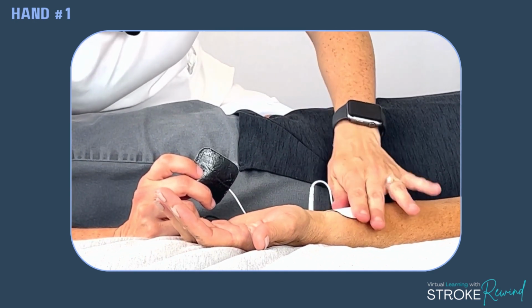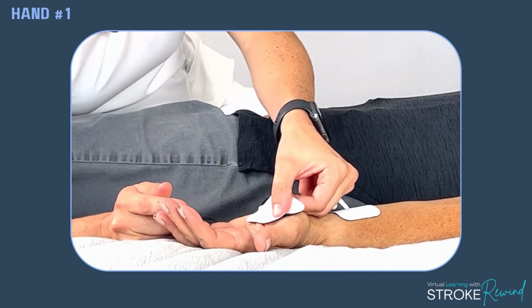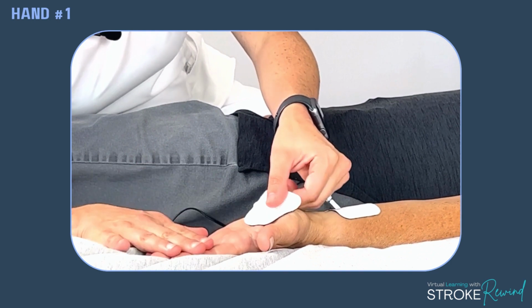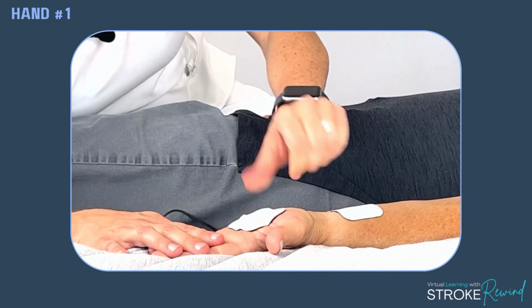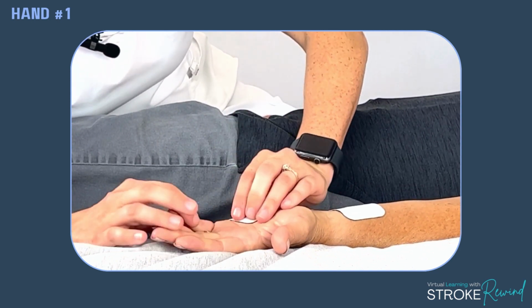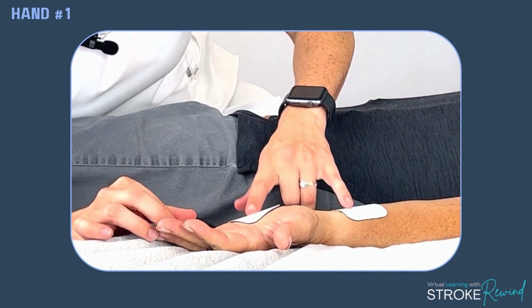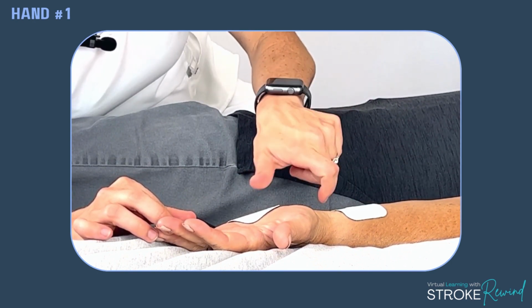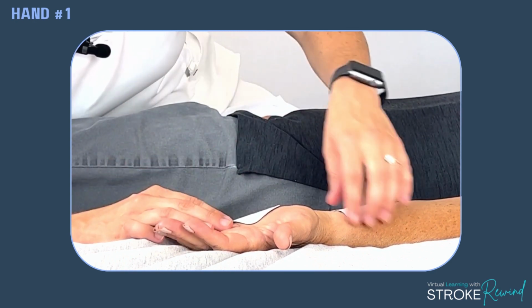Let's say I put the black, see this black electrode up top. I can place this red one maybe by the thumb. Maybe I'm placing it up a little more towards the fingers. Maybe I'm going smack dab in the middle. You can move it to the side to kind of remind Pinky how to move. All you have to remember is wherever you place these electrodes, that stimulation is going to happen between the two, and then it's going to get the muscle to move.